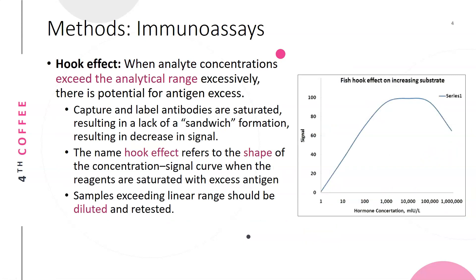The hook effect occurs when analyte concentrations excessively exceed the analytical range. In this situation there can be antigen excess — even though the assay is designed to always have enough capture and label antibodies, if there is so much antigen that the antibodies become saturated, they cannot form a sandwich, which causes a decreased signal.